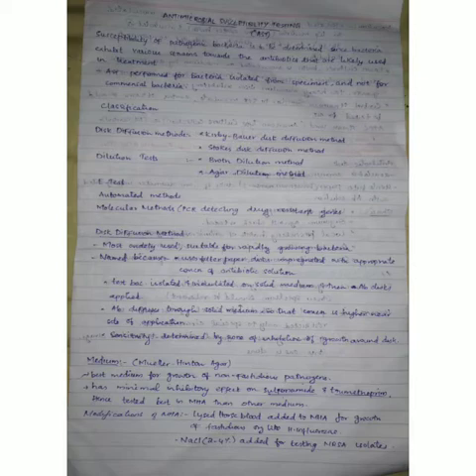You must have studied the culture media, like solid medium and liquid medium, in the previous classes. So here we inoculate it into a solid medium, and then the antibiotic solution diffuses through the solid medium so that the concentration will be higher near the site of application and lower away from the site of application. Now we have to determine the sensitivity to the drug, and it is determined by the zone of inhibition of bacterial growth around the disc.